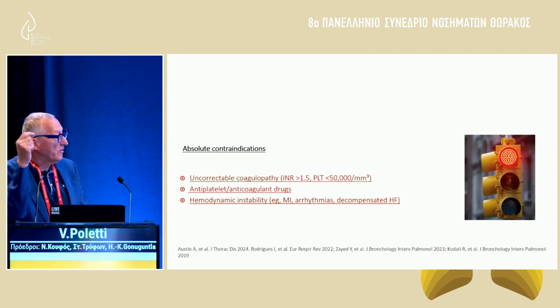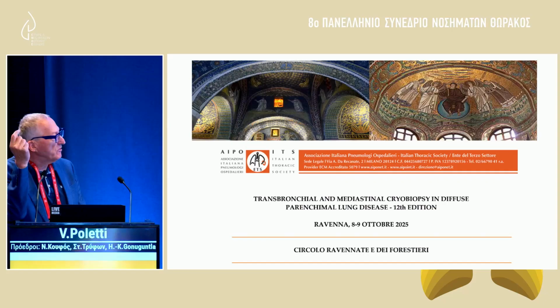Absolute contraindications are, of course, uncorrectable coagulopathy and hemodynamic instability. Common sense, I would say.